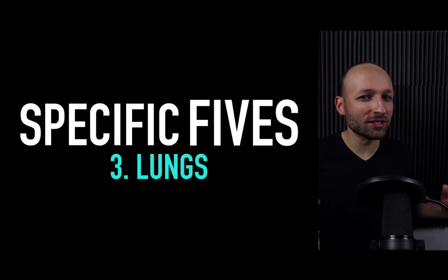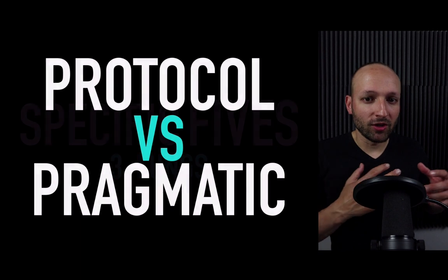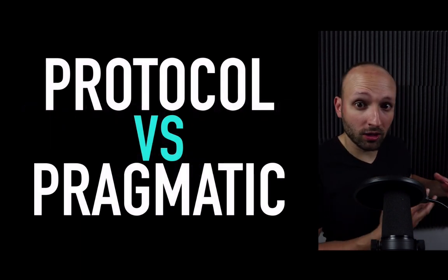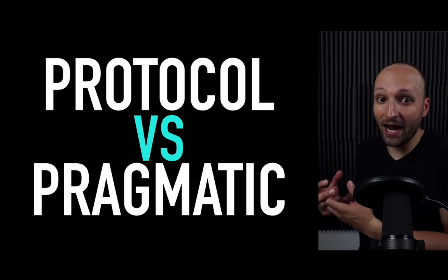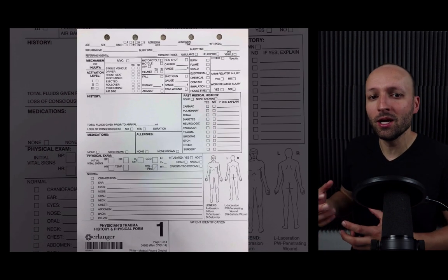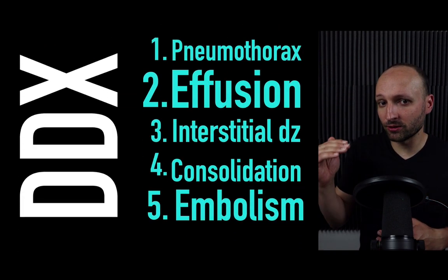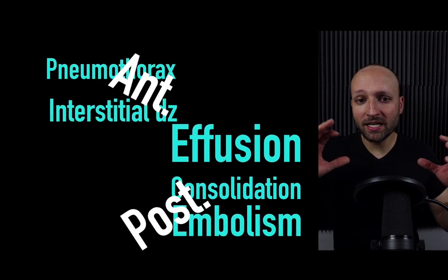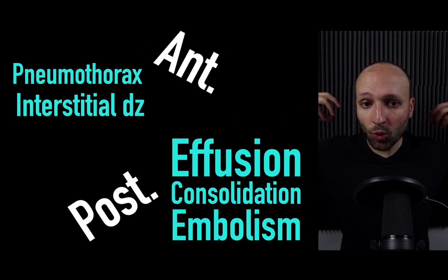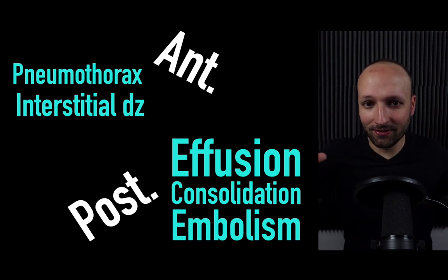With the lungs, I'm going to talk more about exactly how I use lung ultrasound. There are two different ways that you can do it. You can do it in a protocolized manner like the BLUE protocol, or you can do it with a more pragmatic approach, which is really more what I do. I'll get a history, I'll even do my physical examination first, I'll develop my differential diagnosis in my head, and then based off of what I think is the most likely thing, I'll either start in the anterior chest or the posterior chest, rather than scanning everybody exactly the same.